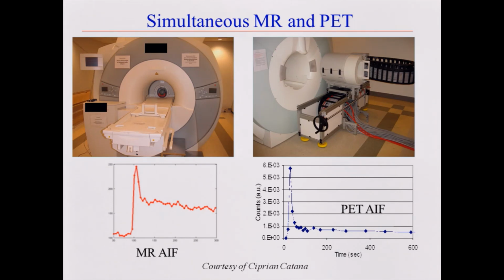You can see the PET insert initially was a head-only insert, went into a clinical 3T scanner. And it allows you to do things like better attenuation correction, motion correction, arterial input function modeling, and really actually does a lot for one's PET image. It allows you to improve one's PET image quite considerably.